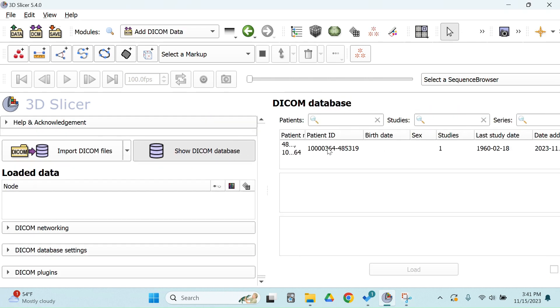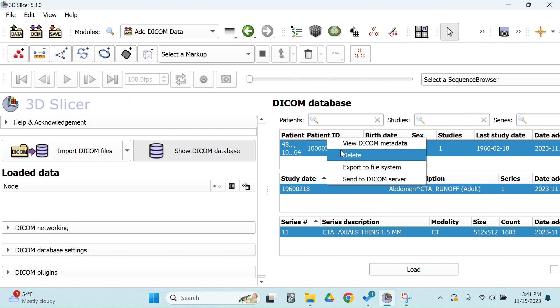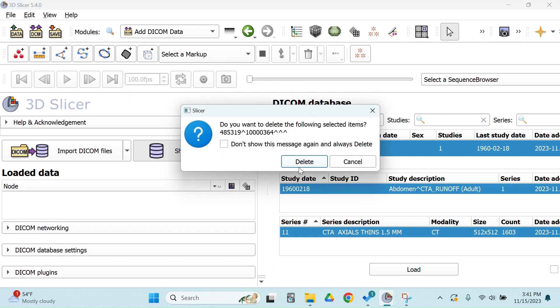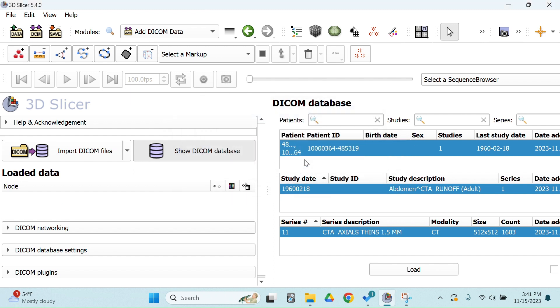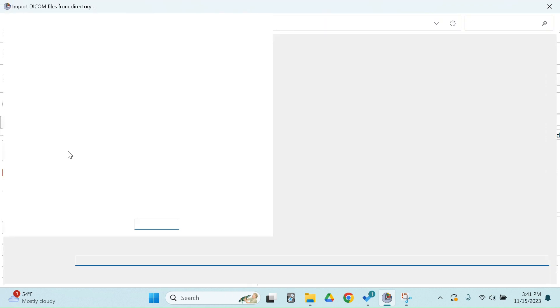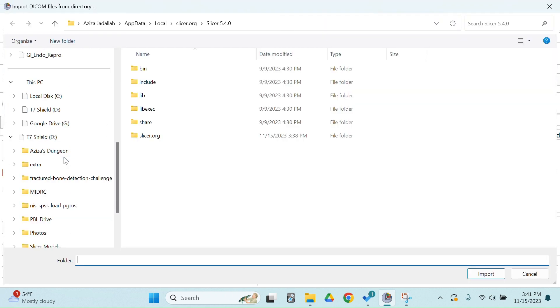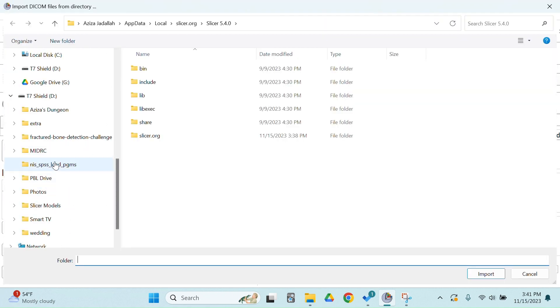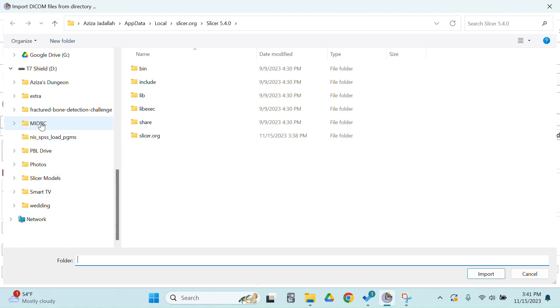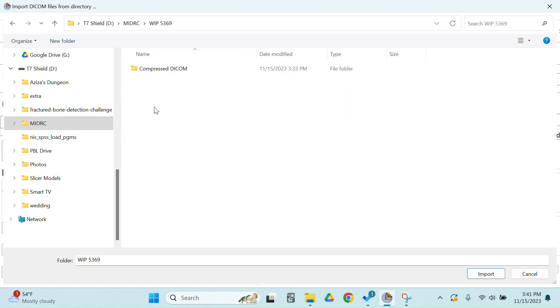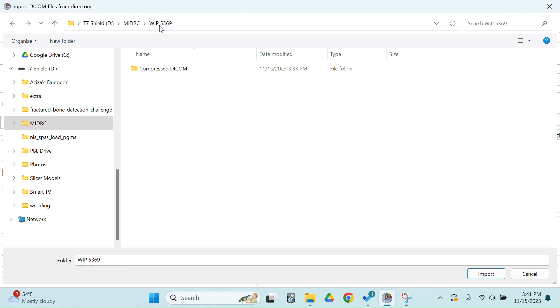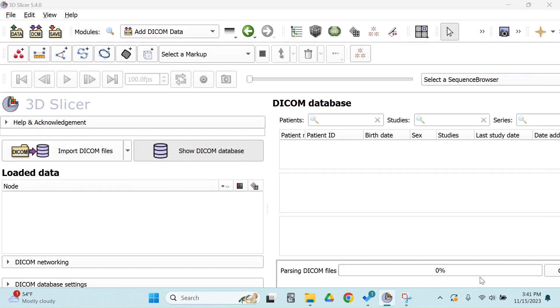So we'll start by adding the DICOM data. I'm going to remove an old study that I no longer need. I'm going to go to import my file. I have these saved on my external drive. And when I open this, you see there's a bunch of different files, and these are different phases of the CT scan. So I'm going to go back, and I want to open the whole file so I can see every view. So I'm just going to select the folder that's one level up.